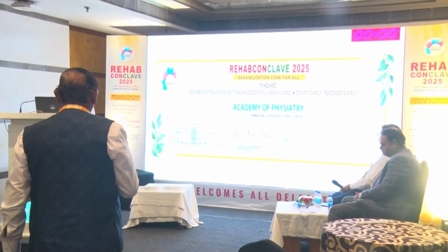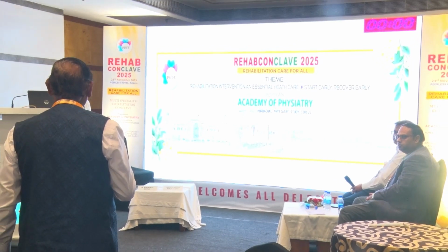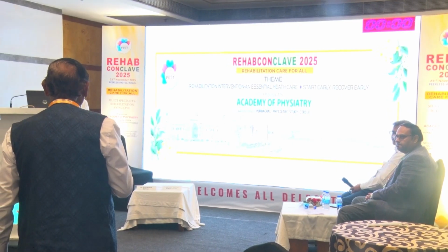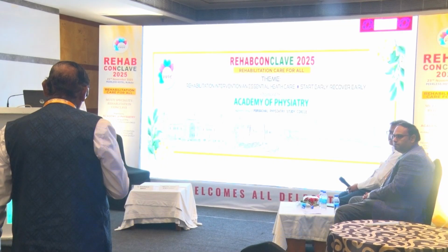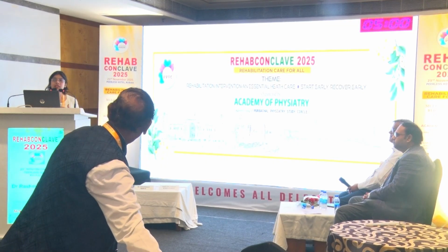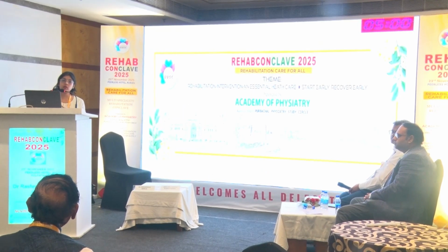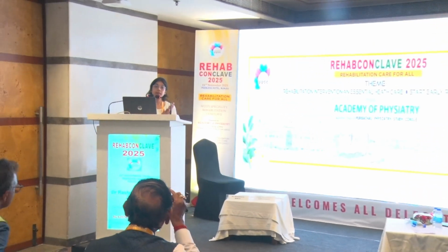The very early stage of rheumatoid arthritis, with the help of high resolution ultrasound, within how many days can it be detected? So within how many days, sir? Sir, I think with the onset of symptoms, in maybe 2-3 weeks, we can detect early synovitis, especially if we look for specific areas.